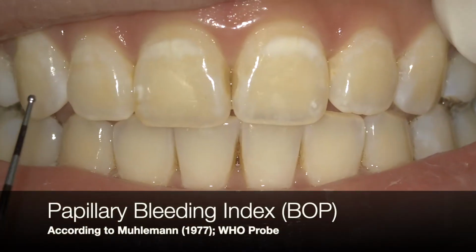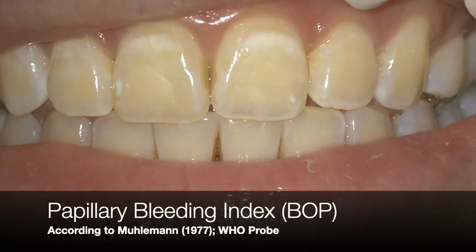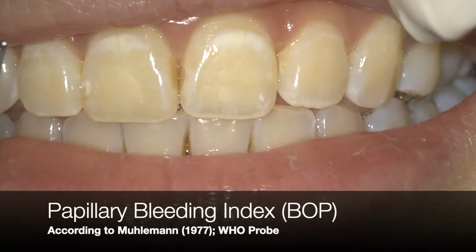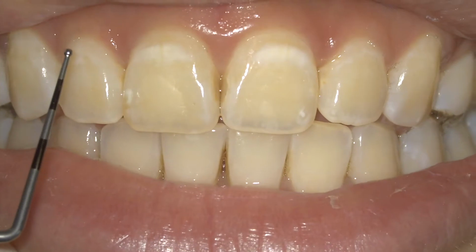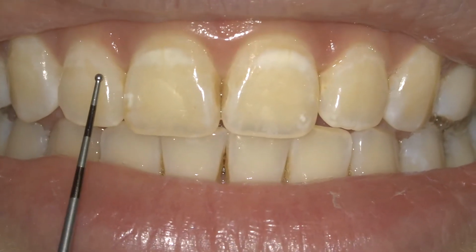Dear students, let me now demonstrate to you how to assess the bleeding on probing in a patient. For this, I will be demonstrating the papillary bleeding index given by Muhlemann in 1977. According to this index, you have to take a WHO probe or any periodontal probe.